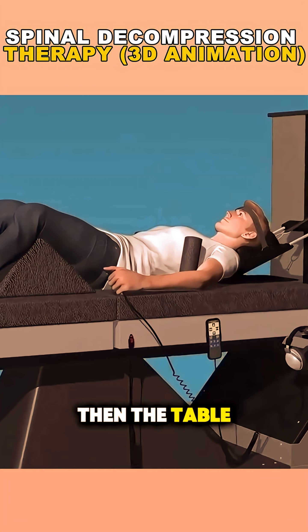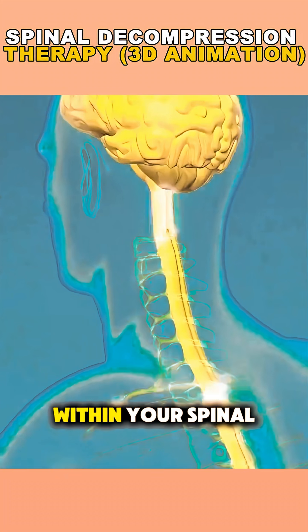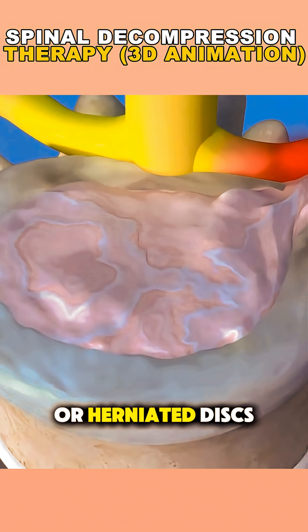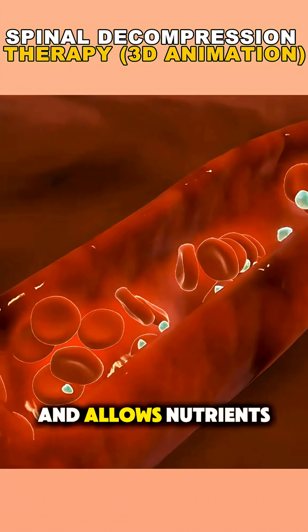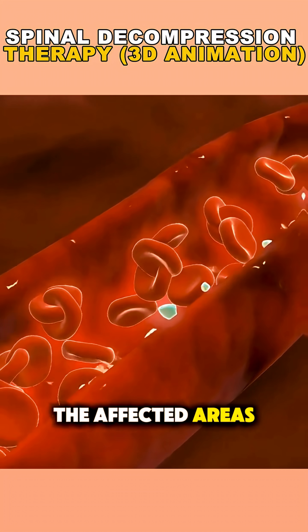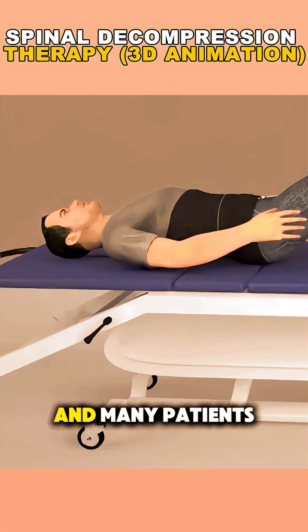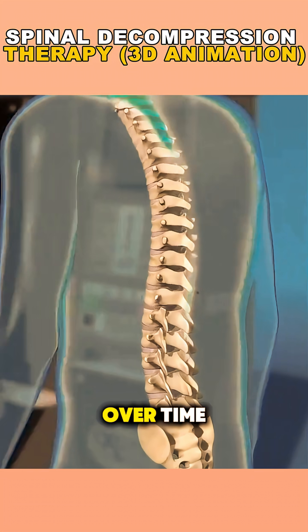Then the table slowly stretches and relaxes in cycles, creating negative pressure within your spinal discs. This helps pull bulging or herniated discs back into place, promotes better circulation, and allows nutrients and oxygen to flow back into the affected areas. Each session typically lasts 20 to 30 minutes, and many patients report feeling immediate relief or reduced pain over time.